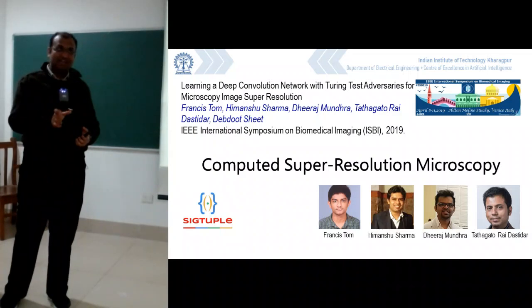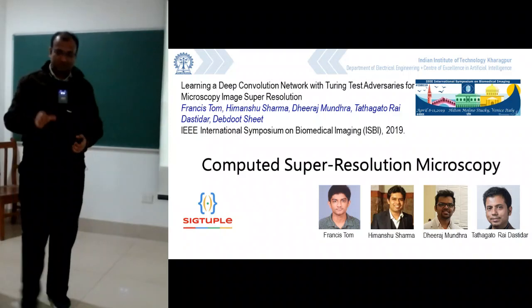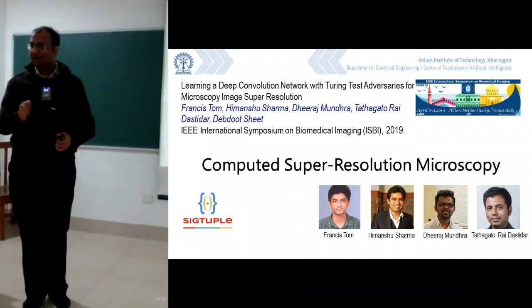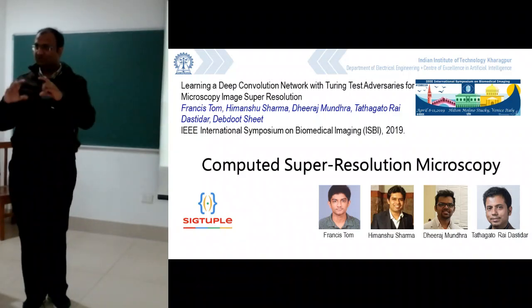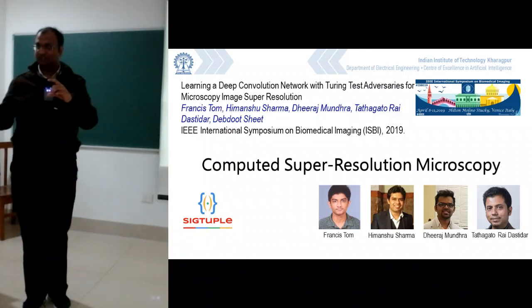If it's at a higher magnification, it's looking at a lower area. Higher magnification, higher numerical aperture, small sized area. So it will have to take more images. When you take an image with your camera, you have to hold it still for some time, then press the shutter, then hold it again. This is called shutter integration time; it needs to collect enough photons and then go to the next image.